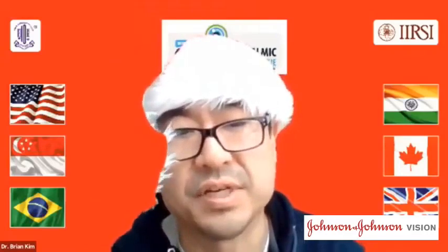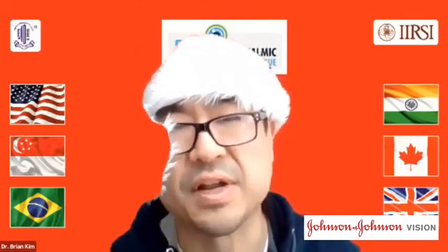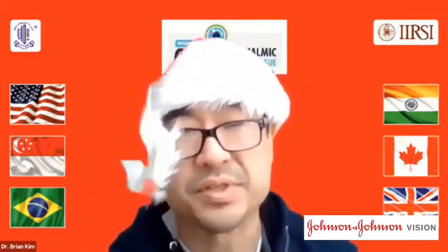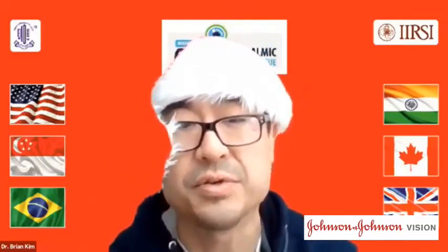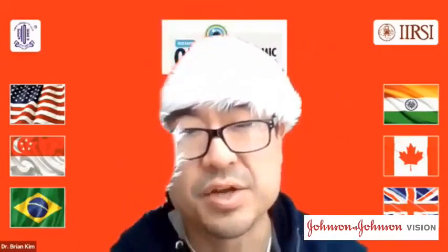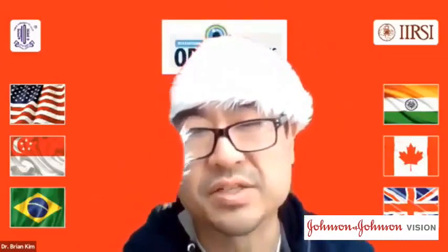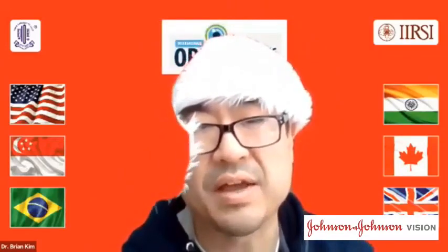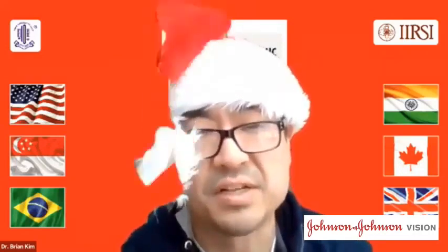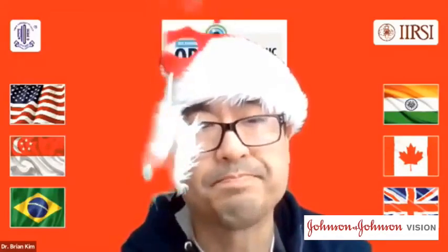Using artificial eyes, I have done this with the MA60 AC lens and was able to successfully cannulate them. If you use PMMA haptic lenses, you have to use a 27 gauge needle. You can't use the 30 gauge thin wall needle that way. But as a novice surgeon learning it, a lens with polyvinylidene fluoride haptics is the way to go.